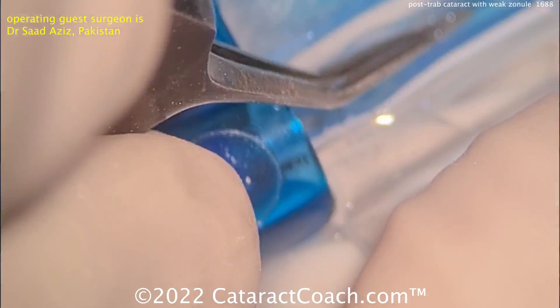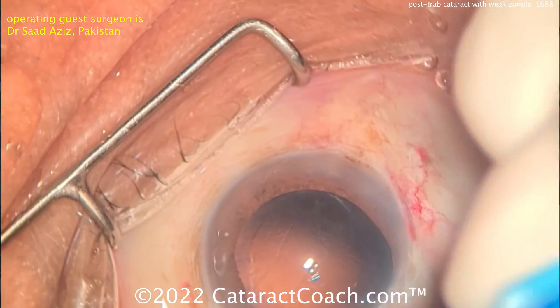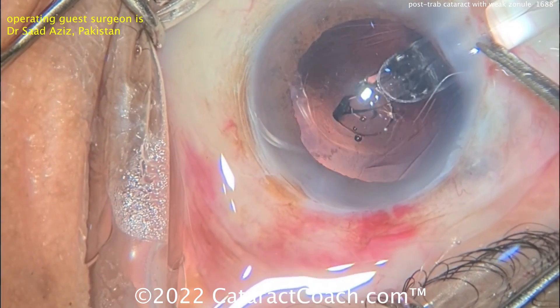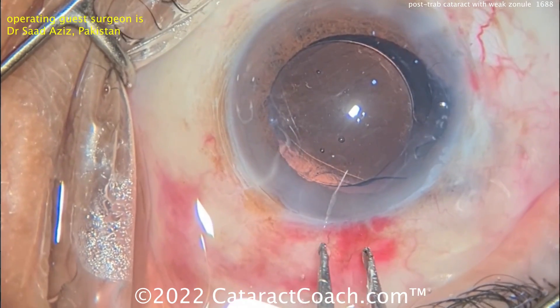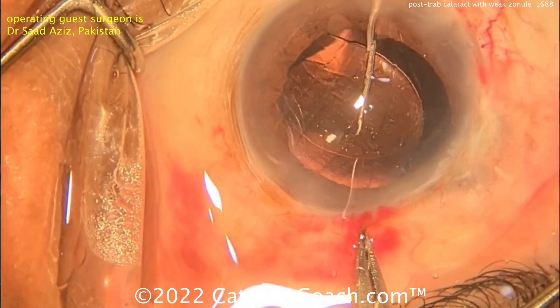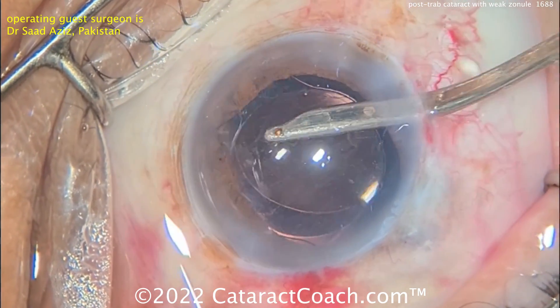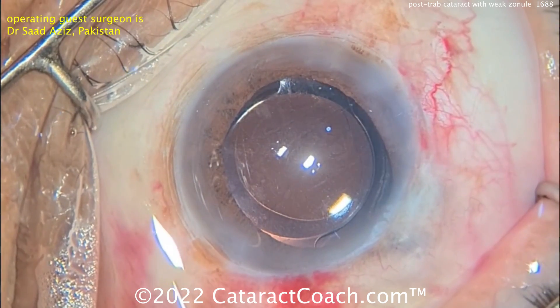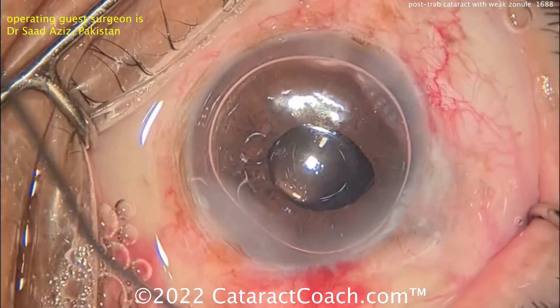That looks great — look at that capsular opening. It looks like an IOL being put into an injector. Get that in the eye. Really nice case — I like the way this surgeon approached it. It's a beautiful outcome for this patient. Hopefully the optic nerve is still reasonable despite the history of glaucoma, and hopefully this cataract surgery will help lower the IOP. If IOP lowering is insufficient, in the post-op period you can do another glaucoma procedure. Cleaning up at the end of the case with viscoelastic coming out of the eye — the rhexis edge is stable. Really nice case. Thanks for sending your case in. I like your CTR placement — great idea and a beautiful outcome for this patient.